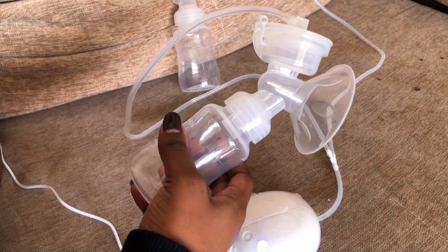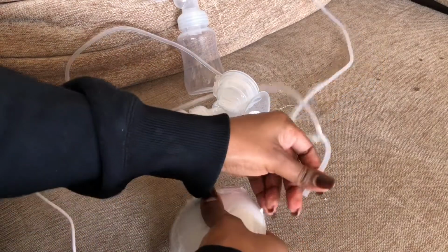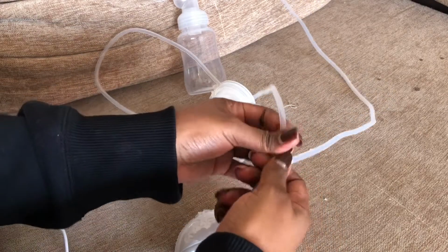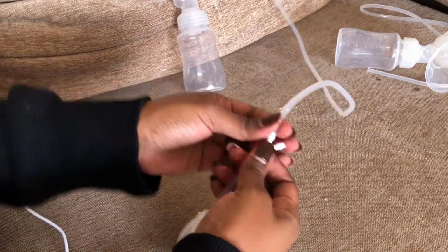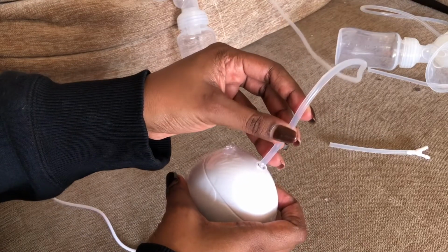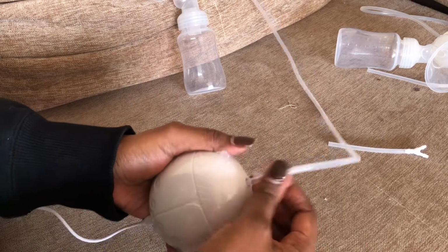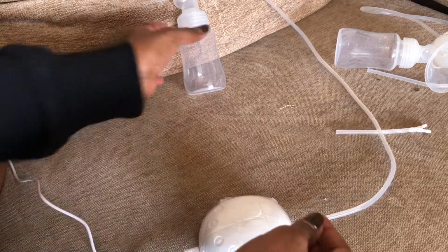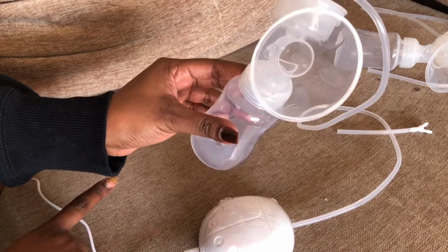So yes guys, let me just undo everything to show you how to fix it when you're using a single pump. So this is how you're supposed to fix it when you're using just one bottle, that is just one pump. You remove everything from here. You remove that part, then you remove one of the tubes because you're using one bottle, that is one pump. So we keep this one aside and you just remove everything. Then you directly connect this pipe here, and then you have your single electric breast pump. So there you go. You can either use it on the left or on the right side of your breast. There's no difference.